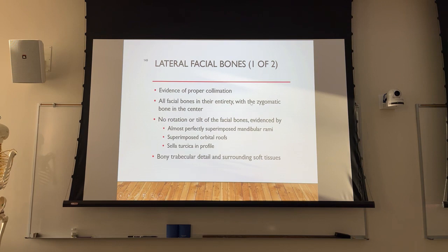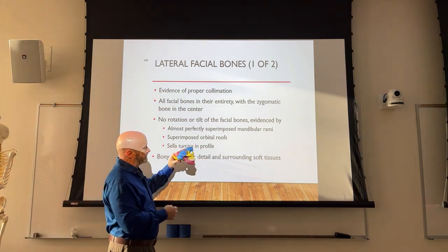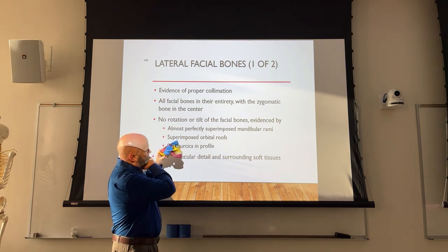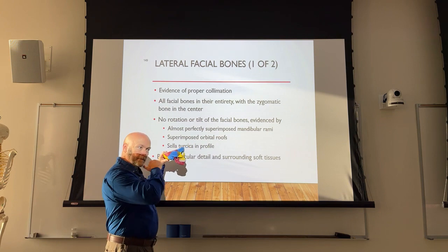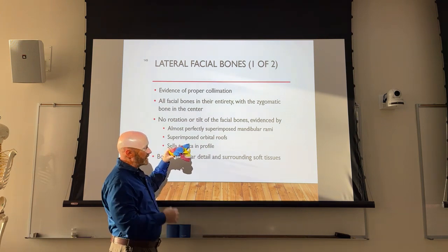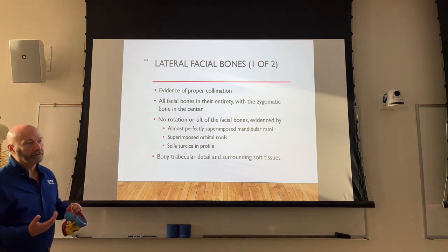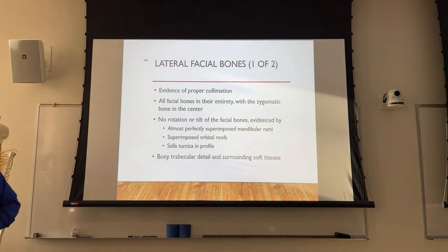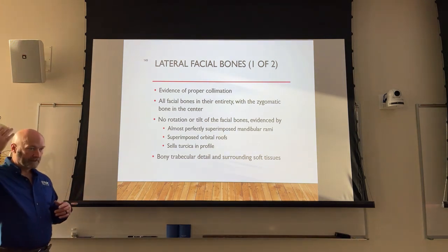Back to positioning: if you remember, the positioning for lateral skull was to extend the chin until the infraorbital meatal line was perpendicular to the front of the image receptor, right? Parallel to the long axis of the collimation. That's the same positioning here. So really the only difference is going to be central ray location and collimation. Positioning wise, it's going to be identical. The evaluation is going to be identical with the exception of what's included.